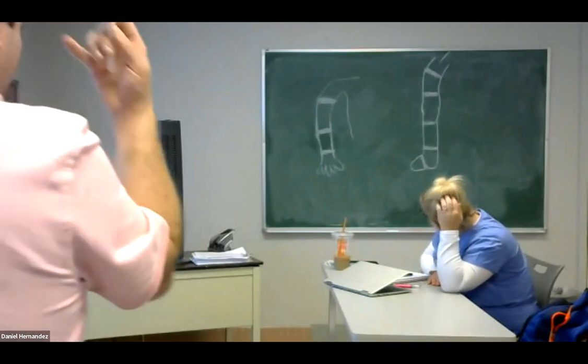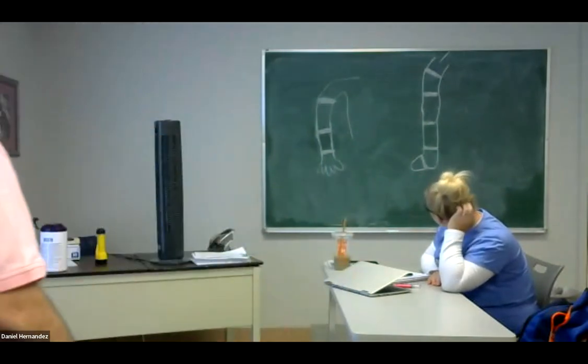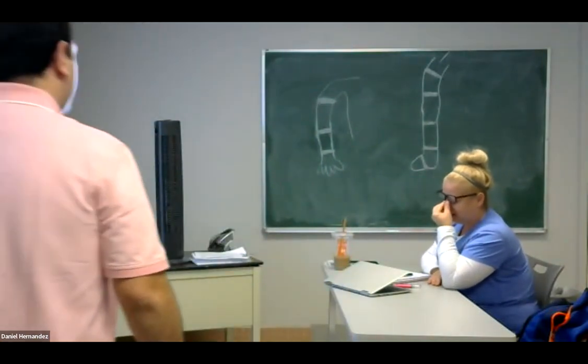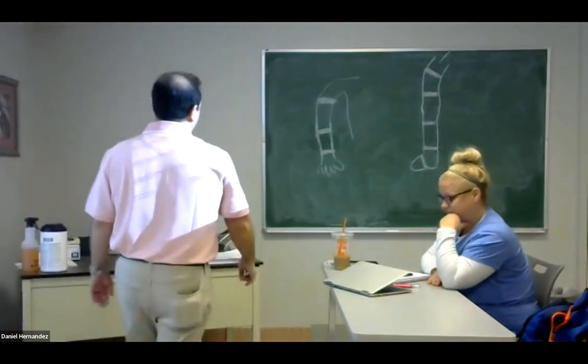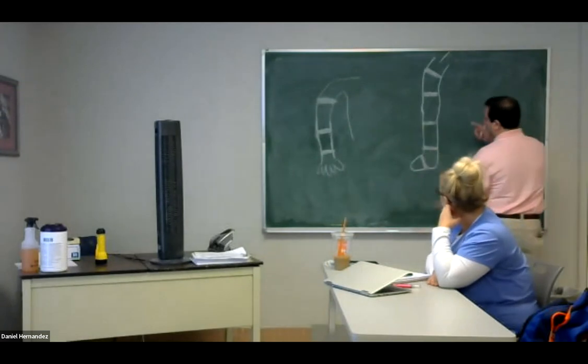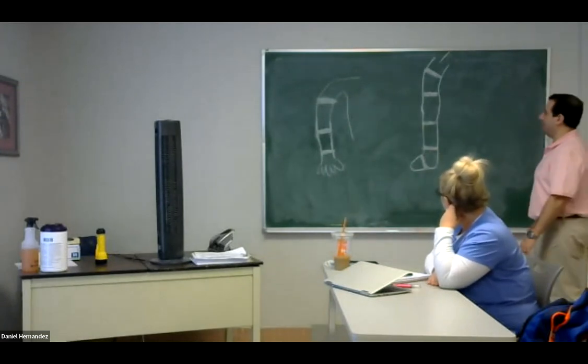If you guys can just visualize what's in the leg, like where the disease would be, arteries, not veins, then you can even isolate segments based on that as well.